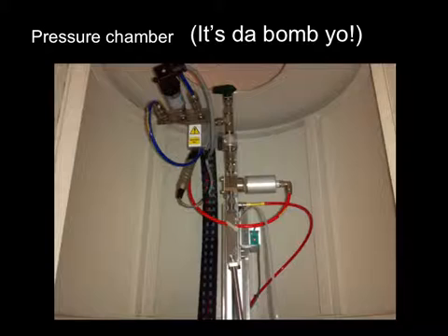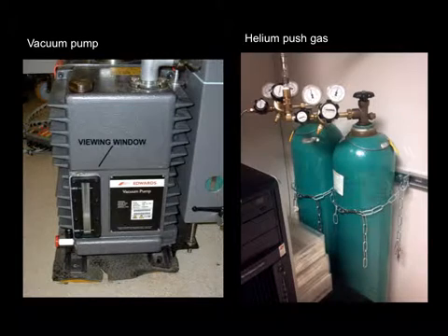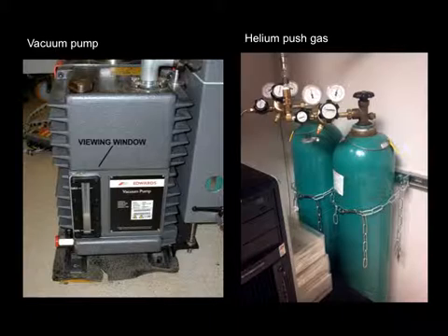And this horizontal position is the closed position, just so you know. There's a couple of the critical accessories that sit right by the Hypersense. There's the big vacuum pump. I think the ones that we have downstairs look a little bit different than this, but it's this big metal thing that's going to sit right by the polarizer. And in the schematic earlier, you saw how this is basically keeping the VTI depressurized.